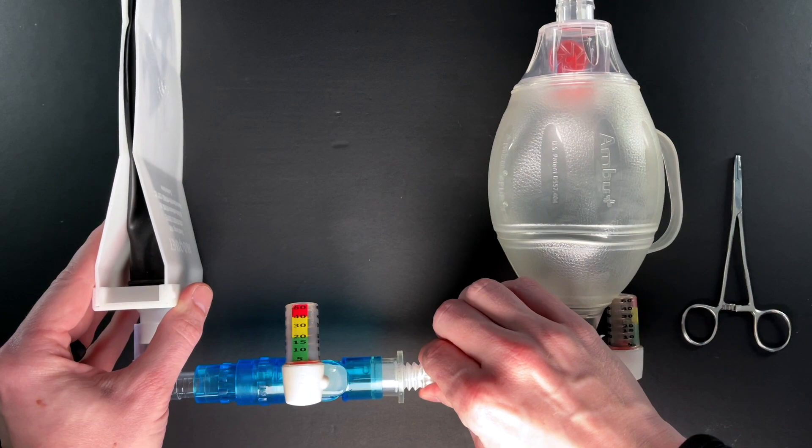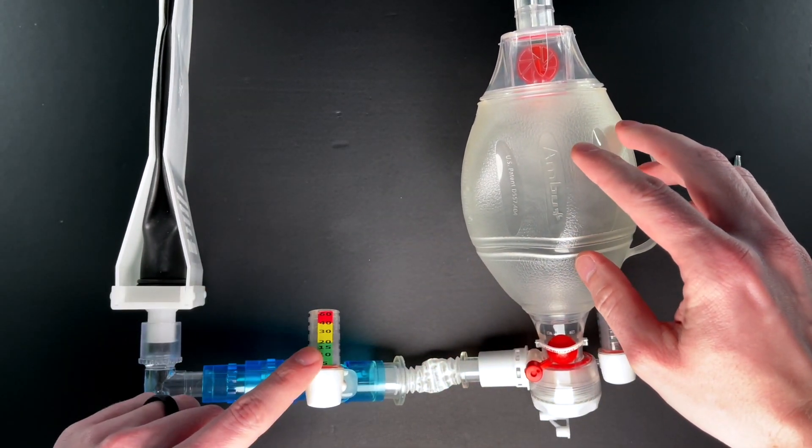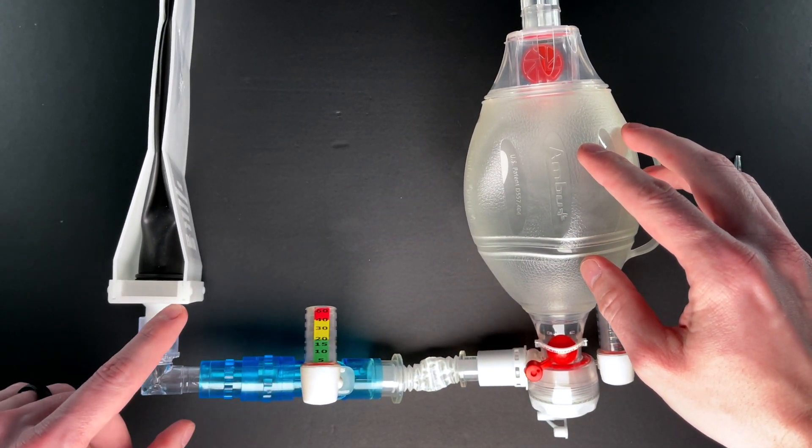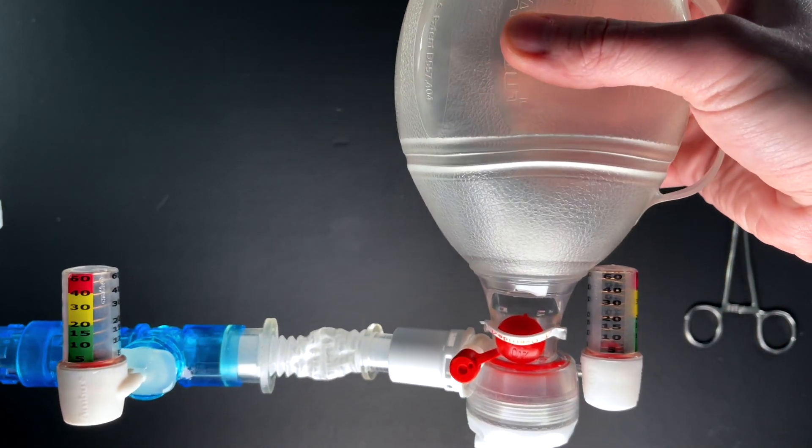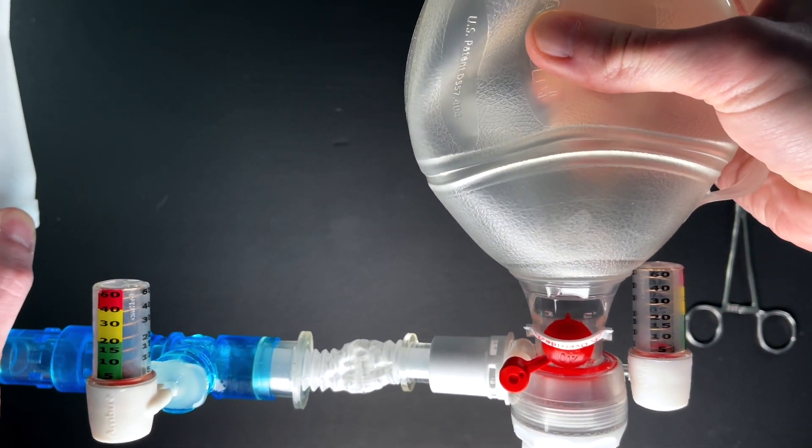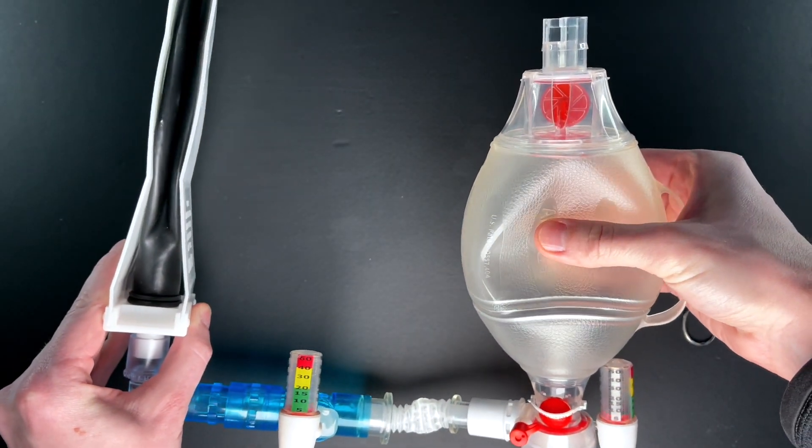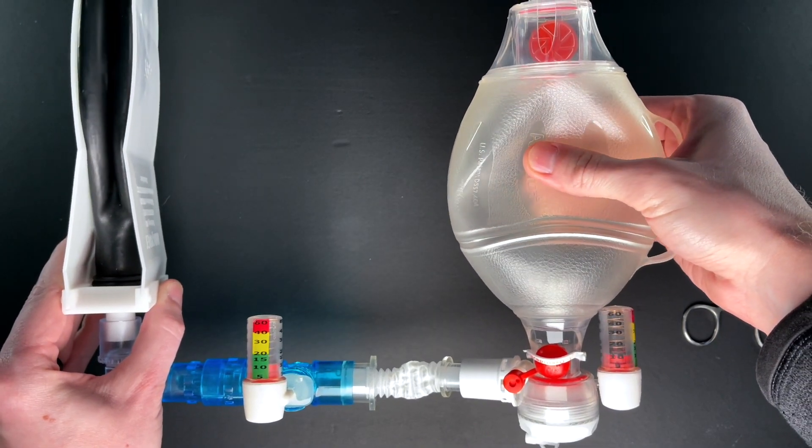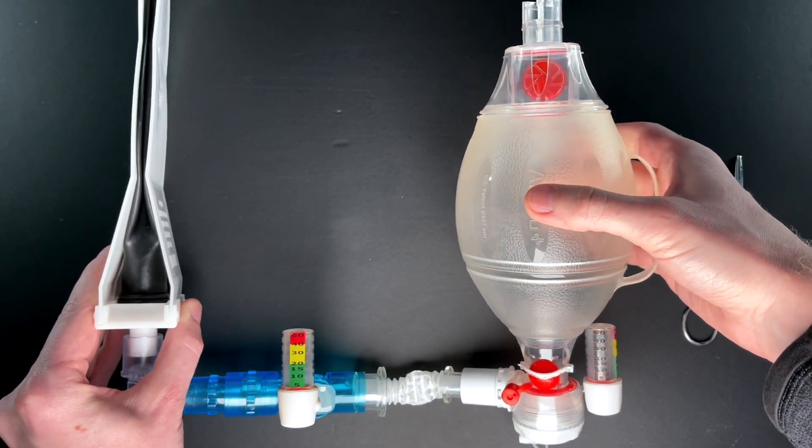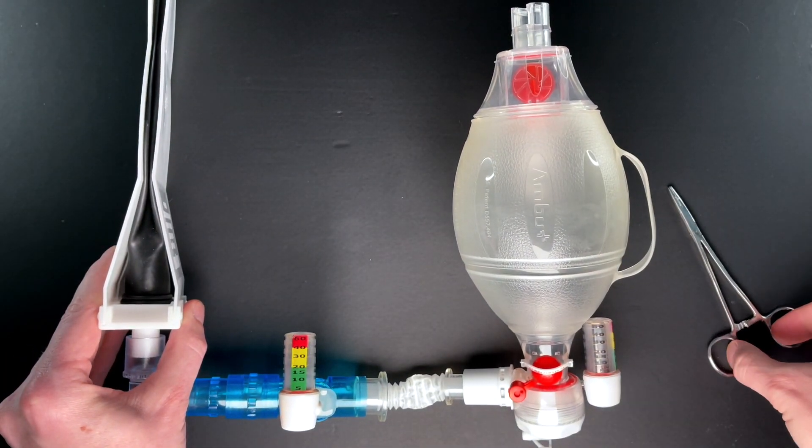The flex is totally open right now, and then there's another manometer here that's connecting to the test lung. We should see when I squeeze this that the pressure manometers are pretty equal. The test lung inflates and deflates like we would expect, and everything is normal.